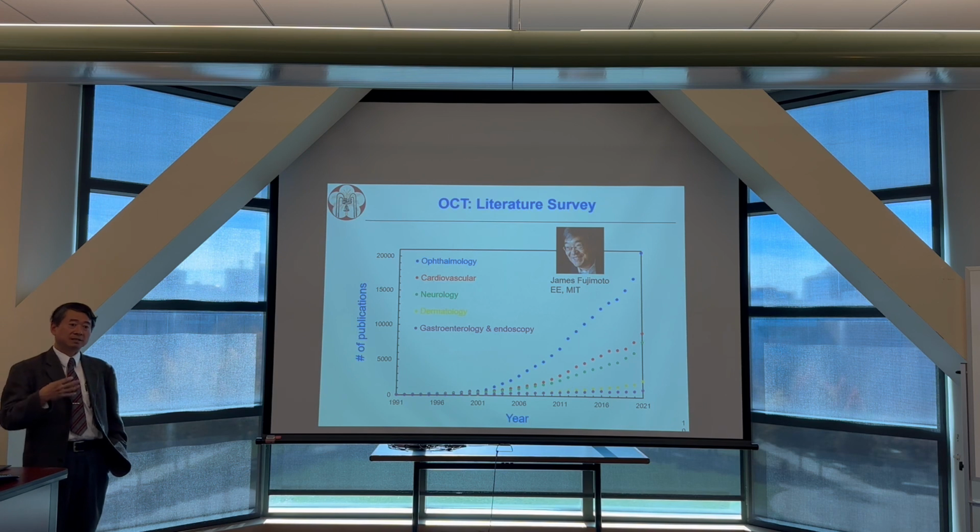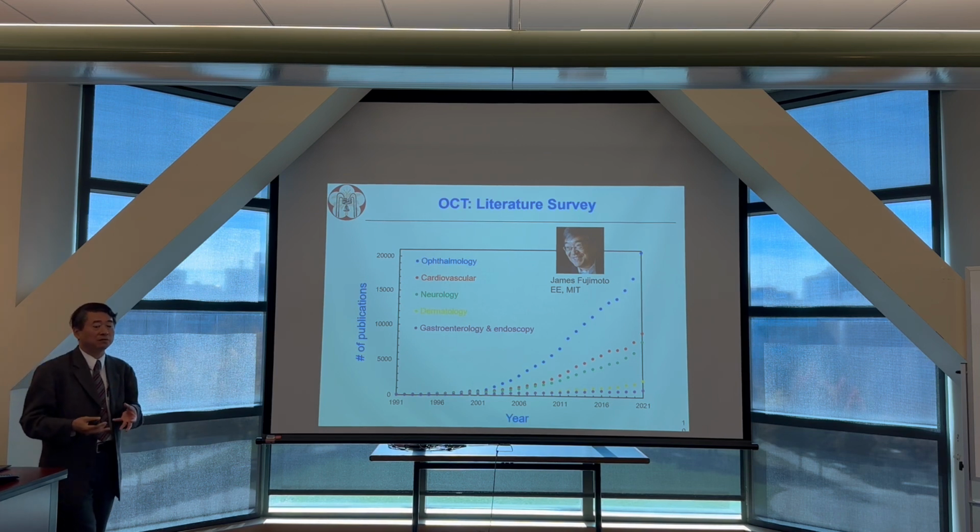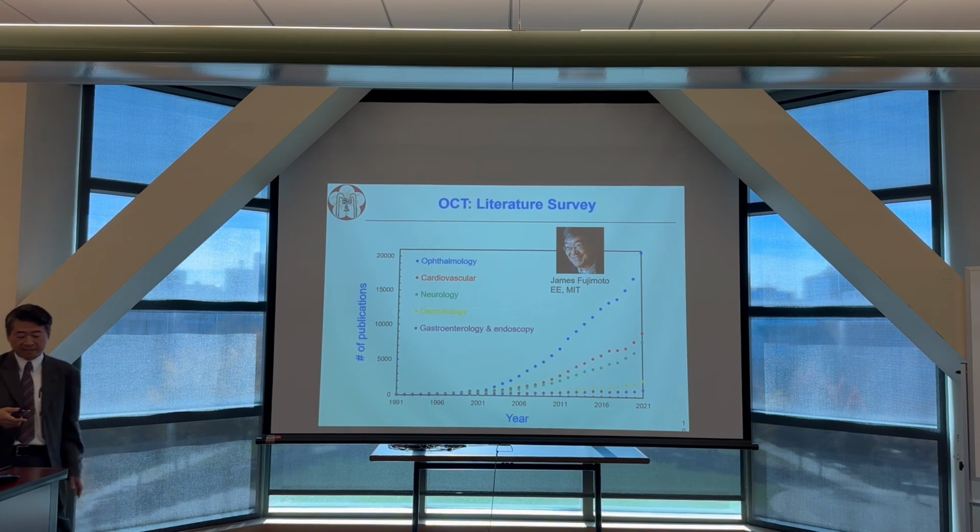Recently, people care not just about the imaging speed but also about the resolution, because you want to see the details. For example, you want to see the cells and the nuclei, because for many diseases, for example cancer, you can get more detailed information about the cell, and then make a diagnosis.